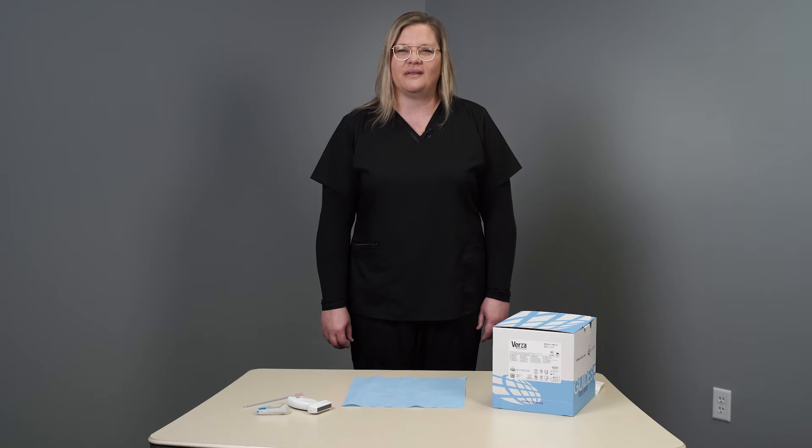I'm Jennifer Steberg, the senior associate product manager for guidance at CivCo. Today I'll be showing you how to assemble the Versa guidance system.